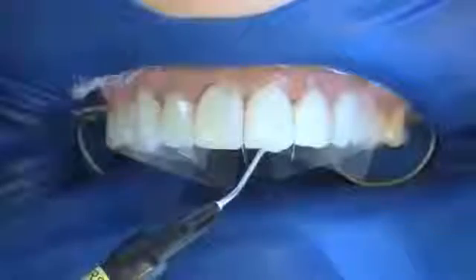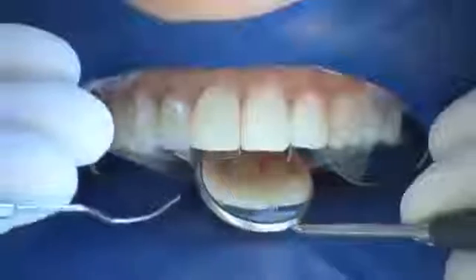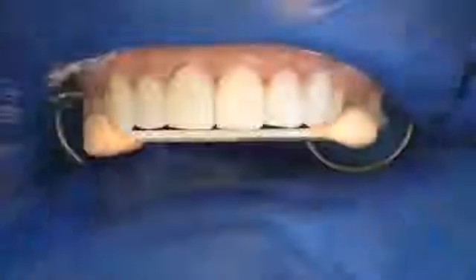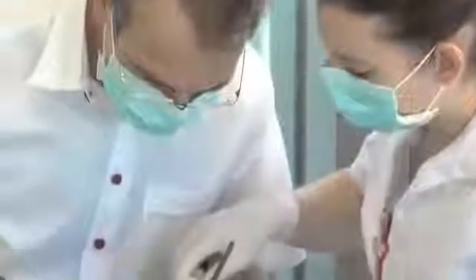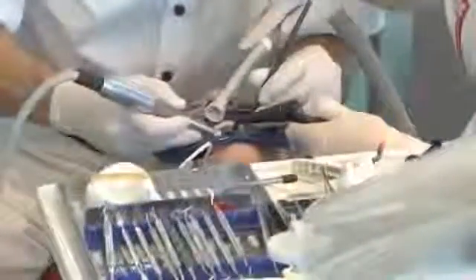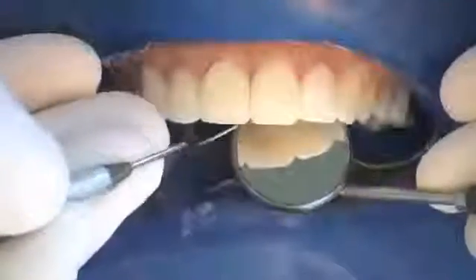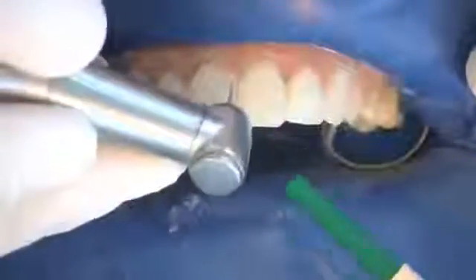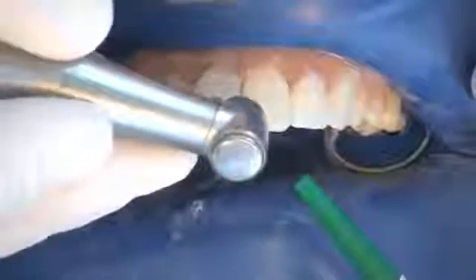The marginal areas can be sealed with a flowable composite to ensure marginal integrity. The tooth axes and tooth lengths are checked before finishing. Large excesses are removed palatally with a pear-shaped coarse diamond burr and the surface continuity checked by a probe. Cervical areas, especially towards the interdental areas, are treated with a thin 40 micrometer flame-shaped diamond burr.